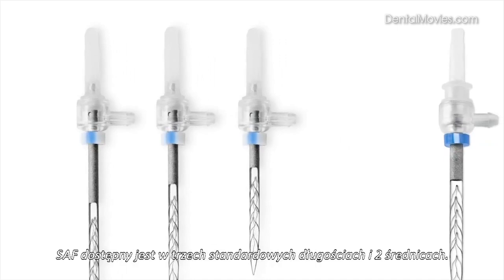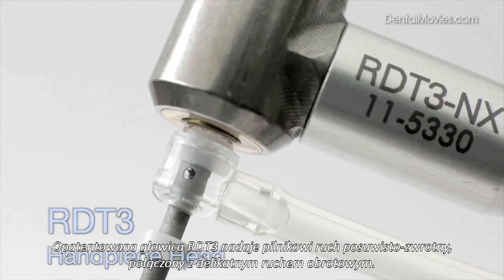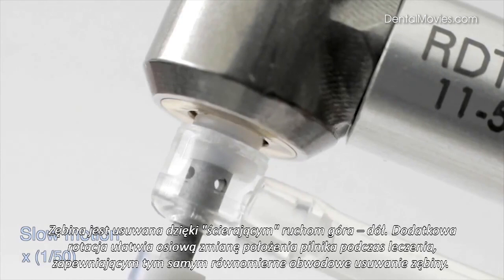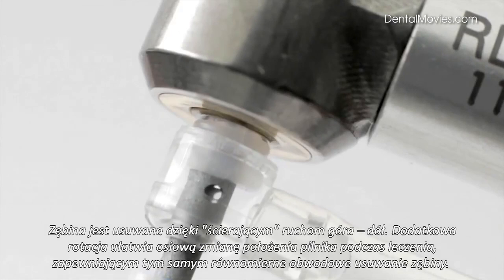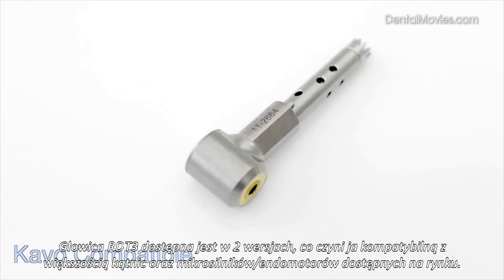The SAF is available in three standard lengths and two different diameters. The patented RD-T3 handpiece head delivers sonic speed vertical vibrations combined with slow, low-torque rotation. Dentin is removed by grinding the file in a rapid in-and-out movement against root canal walls. Additional rotation helps change the file's axial orientation during treatment to ensure dentin removal is uniform circumferentially. The RD-T3 head is available in two configurations, making it compatible with a variety of contra-angle handpieces and motors.